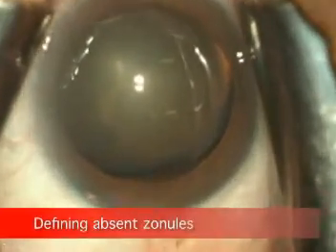In a case of zonular dehiscence, the surgeon never knows the exact extent of the dehiscence from beginning to end. The intraocular mirror is also useful in this situation; the surgeon can see the area where there is no zonule.